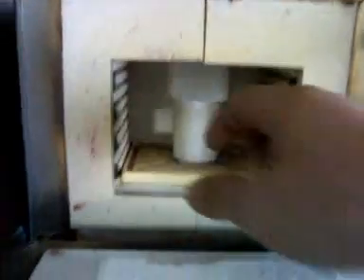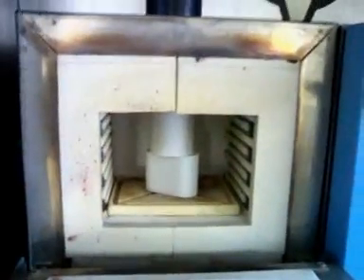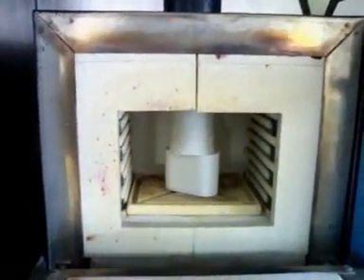Once it's heated at a certain point, we're going to pull it out, put our metal in here, put it back, and let it get to a high temperature. Once we've done that, we're going to bring it to high temperature, so even our metal is going to be hot once we put it in the Enterprise.